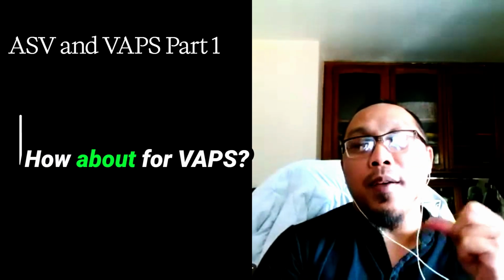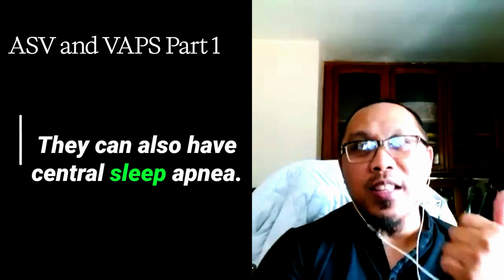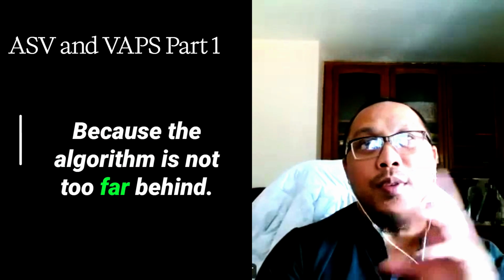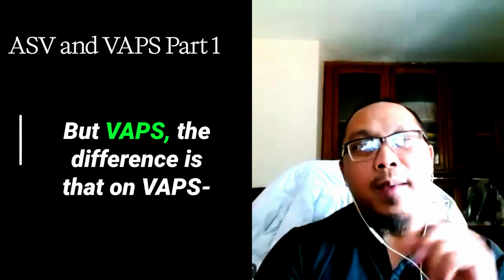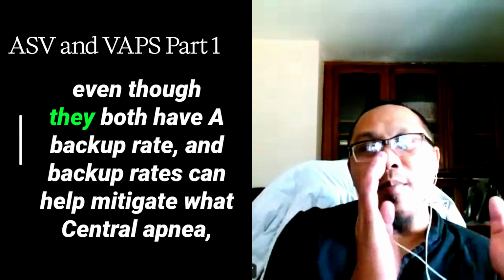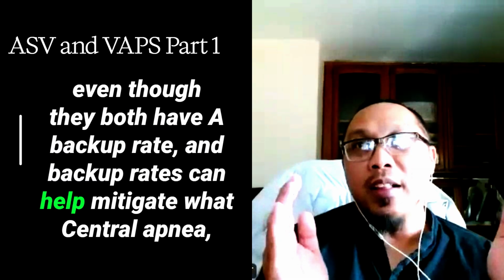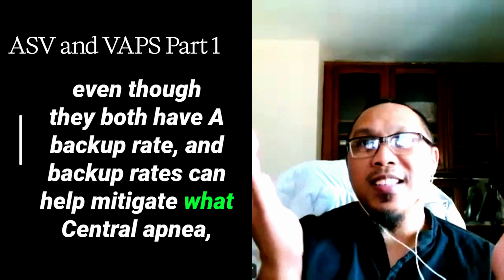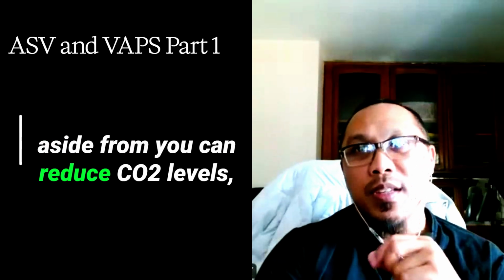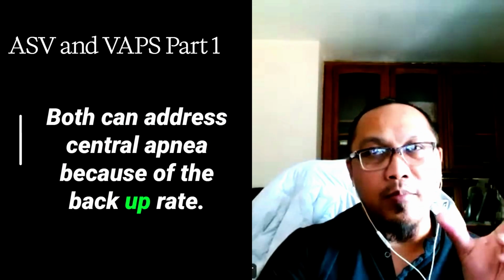Check. How about for VAPS? Yes, they can also have central sleep apnea, because the algorithm is not too far behind. But with VAPS, the difference is that, even though they both have a backup rate, and backup rates can help mitigate what? Central apnea. Aside from reducing CO2 levels, both can address central apnea because of the backup rate.